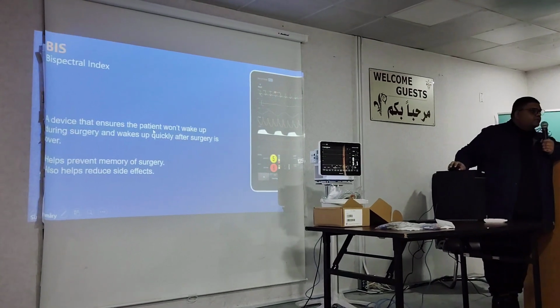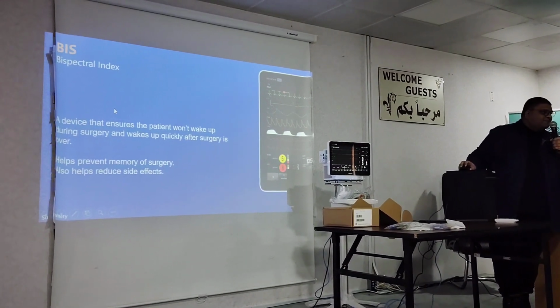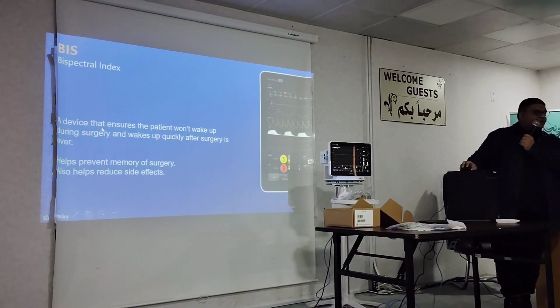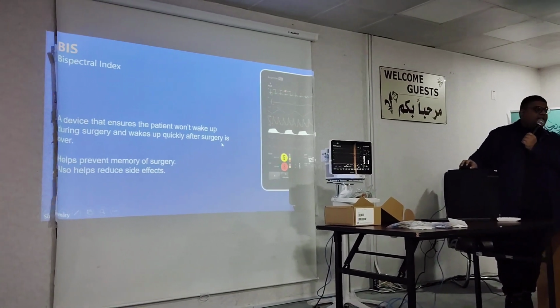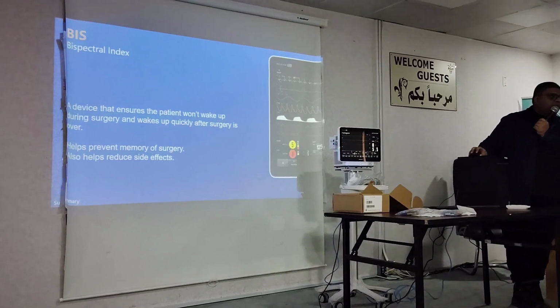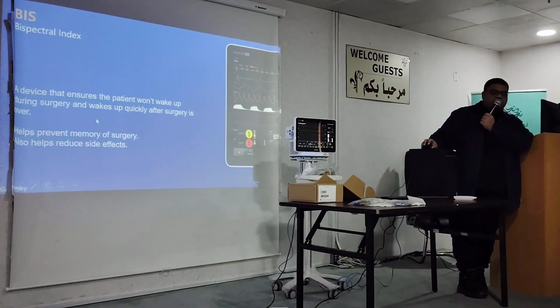You know what's the purpose of that? The purpose is you don't want your patient to wake up during surgery, right? If a patient wakes up, that's game over. And then you also want to make sure that they wake up quickly after surgery by not giving them an overdose. You don't want them to overstay in the post-anesthesia care unit.